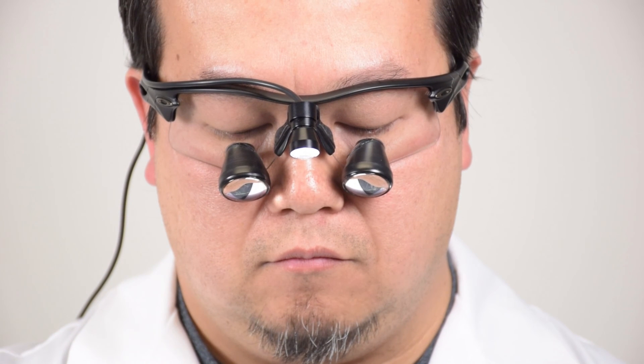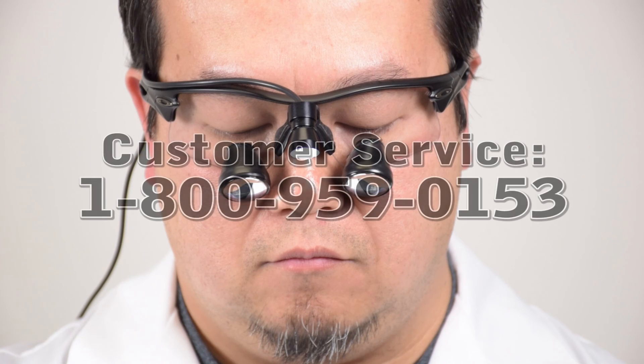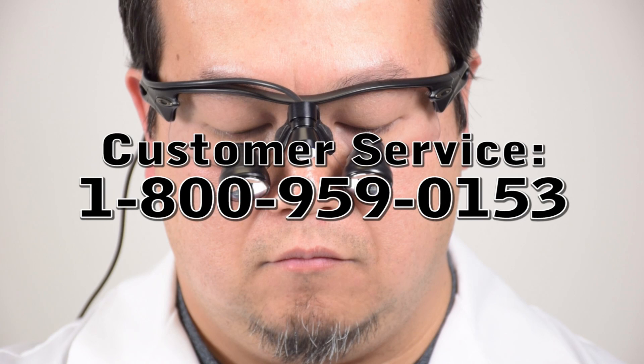With these techniques, you will be able to center your light beam on your target in most cases. If you need help with this procedure, please contact Surgical or Tele Customer Service at 1-800-959-0153.